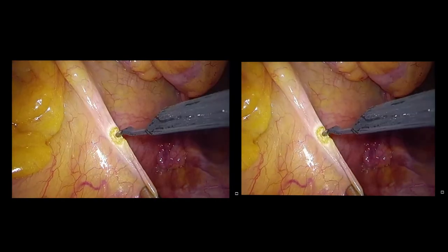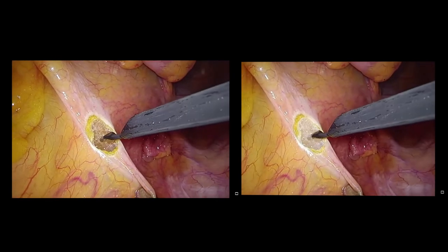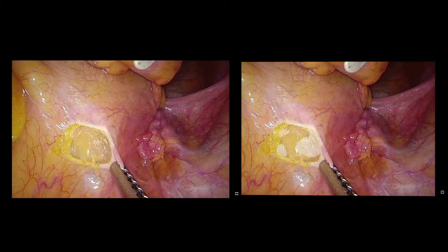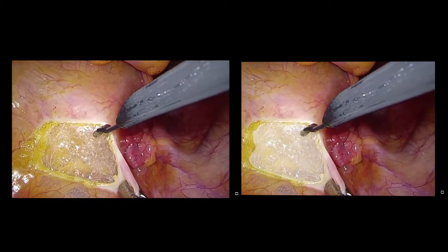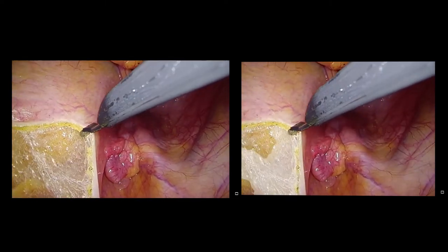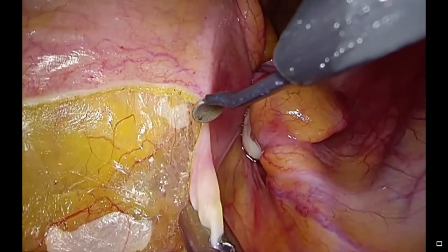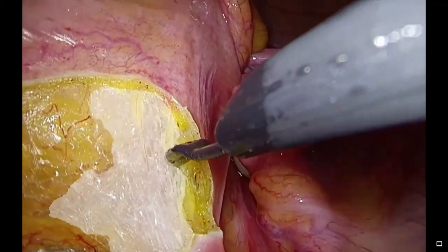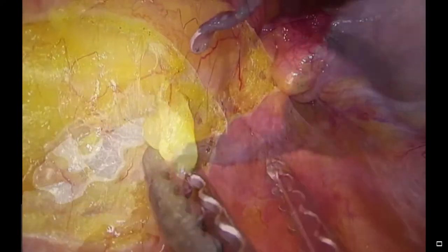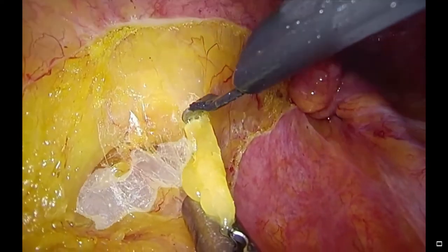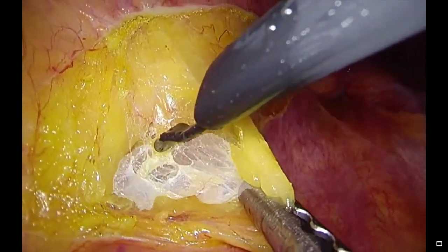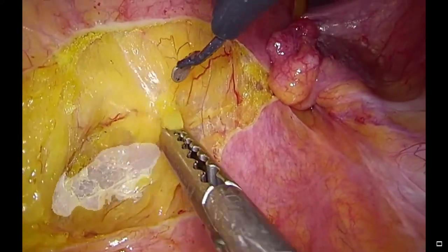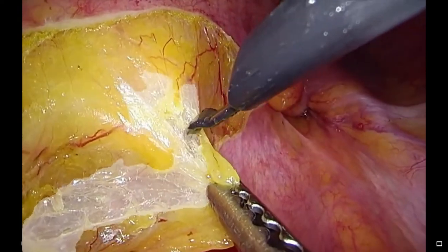Here are some actual TME surgery videos highlighting the predicted results of this model. An avascular areolar tissue plane lies between the mesorectal fascia and the parietal pelvic fascia. Appropriate traction enables us to identify the areolar tissue. Meticulous sharp dissection along this embryological plane could maintain an oncologically safe and complete removal of the rectal cancer.